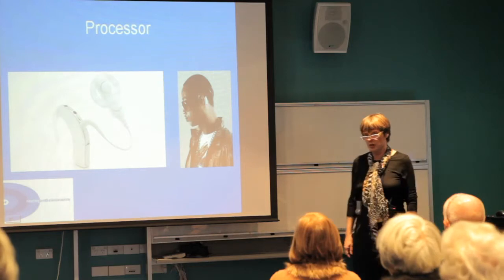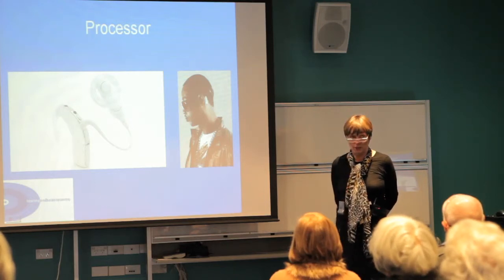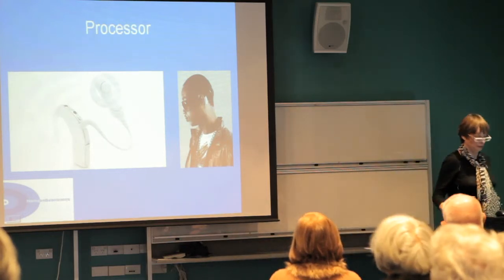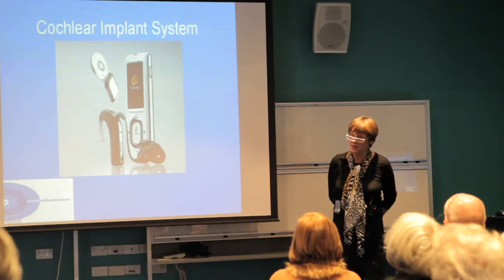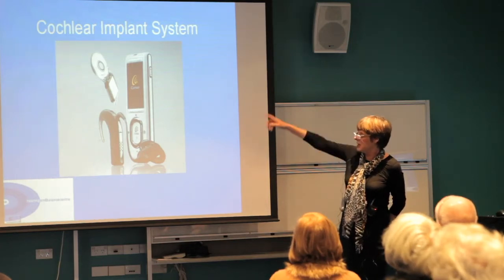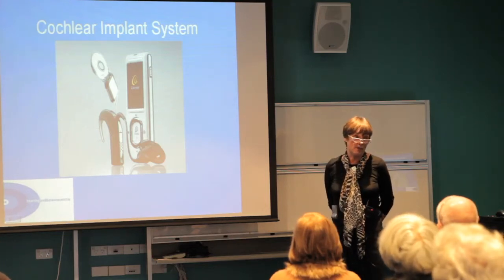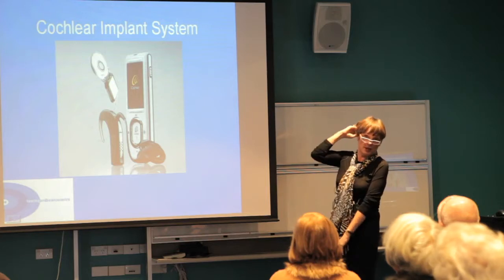This is a picture of the most recent cochlear implant, and the most recent speech processor, which does look something like a hearing aid, except that it has the coil attached. And this is somebody wearing a speech processor. This is the whole system, the current system. There's been many changes, some of which I'll show you. This is the most recent device, and you can see the implant, the speech processor, and also there's now a remote control, which has been a major help with our patients, because it's a lot easier to change programs and change volume, etc., with a remote control than it is to be fiddling up at your ear.